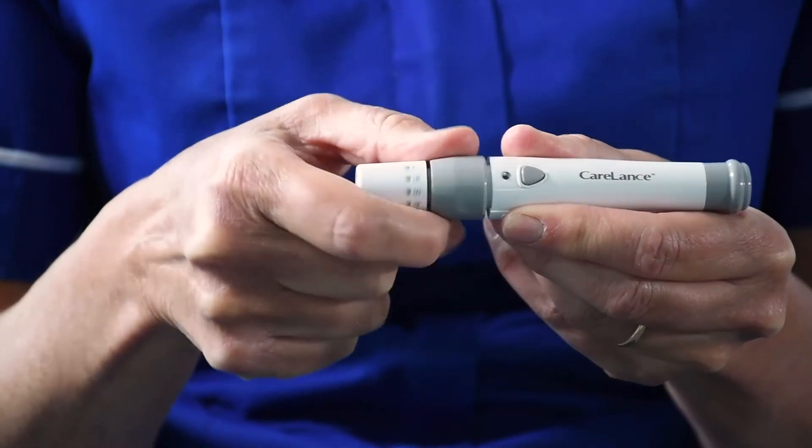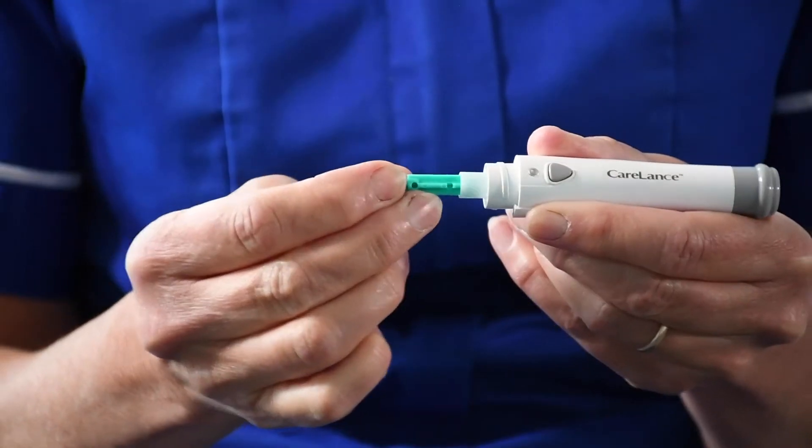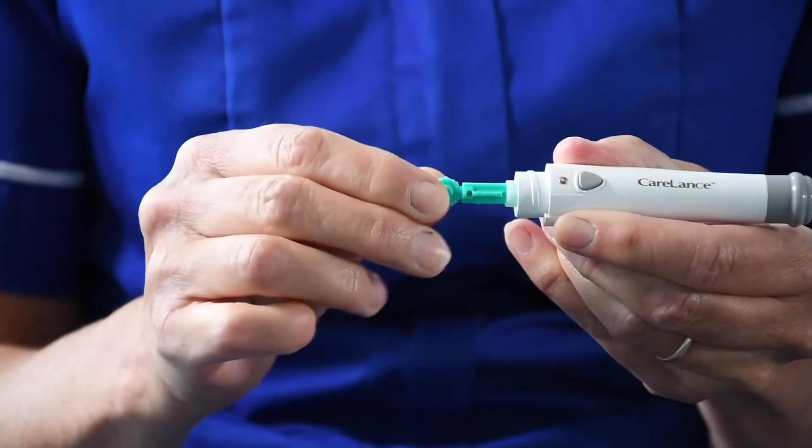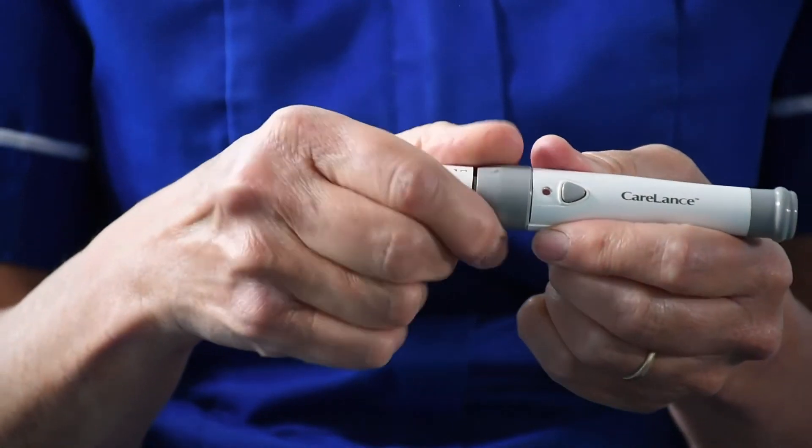You need to prepare your finger pricker. Your finger pricker might not look exactly like this but again the principle will be the same. Take off or unscrew the end. Take your lancet and put it into the end of the finger pricker. Unscrew the protective cap on the end of the lancet and you can throw that away. Put the lid back on the finger pricker.